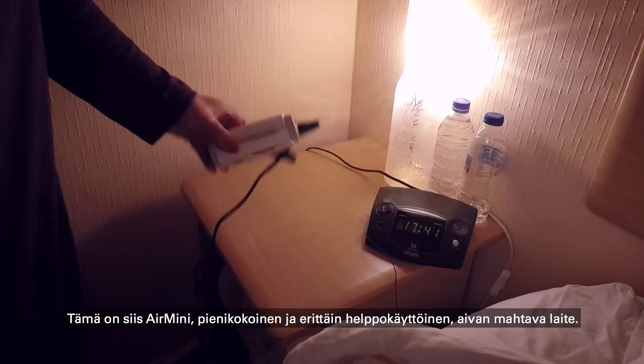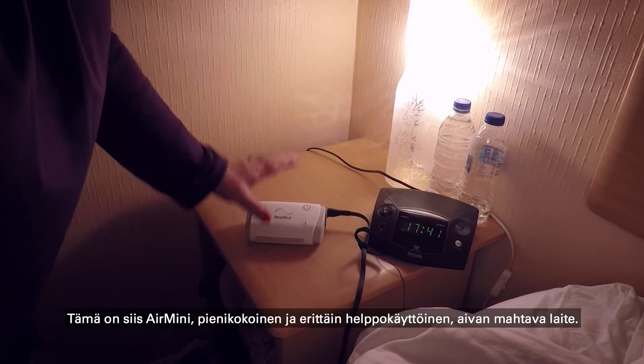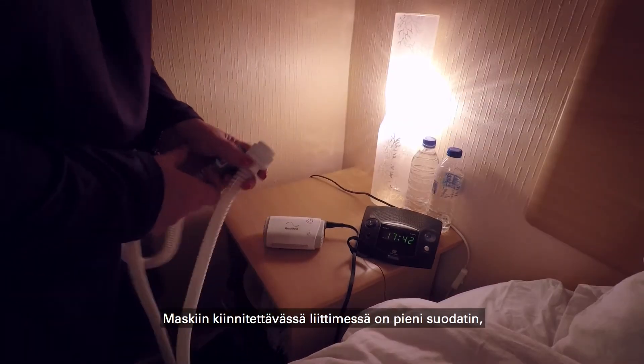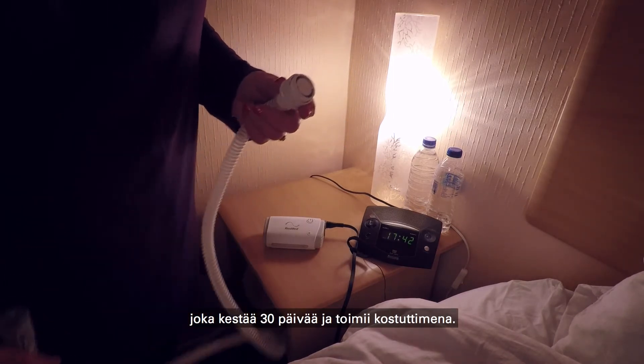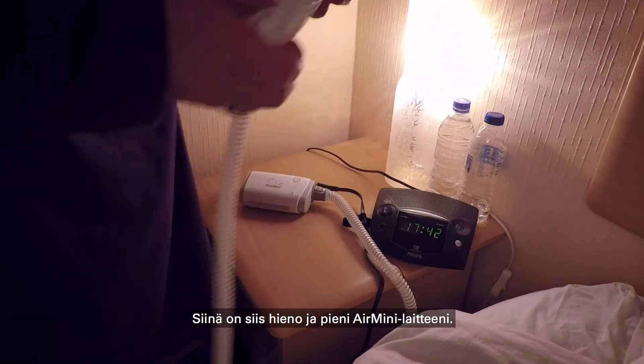So, this is the Air Mini. As you can see, it's very small. Very simple to operate. Absolutely wonderful. It simply has this little filter in the connector which goes to the mask, and that lasts for 30 days, and that works as a humidifier. That's my wonderful little Air Mini machine.